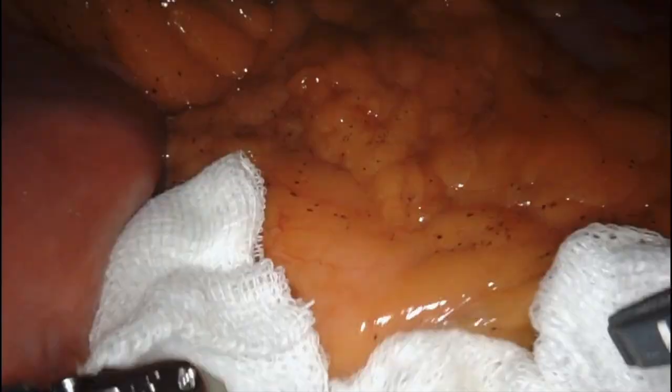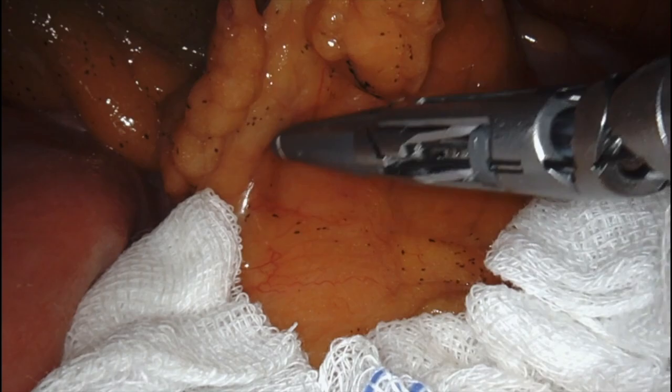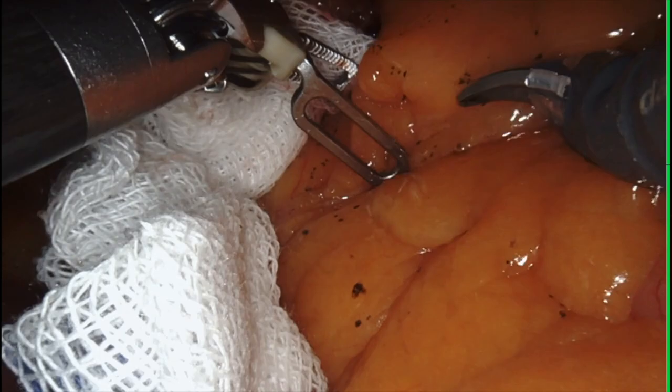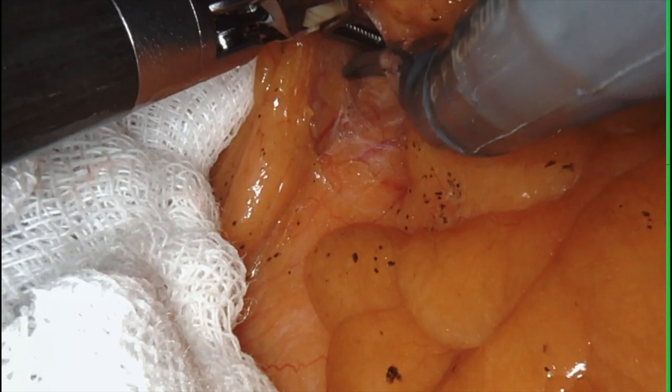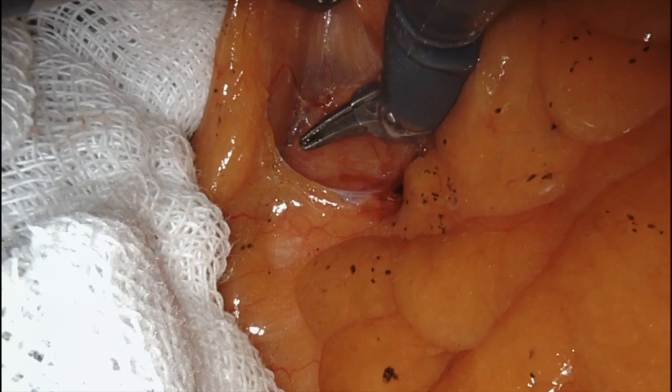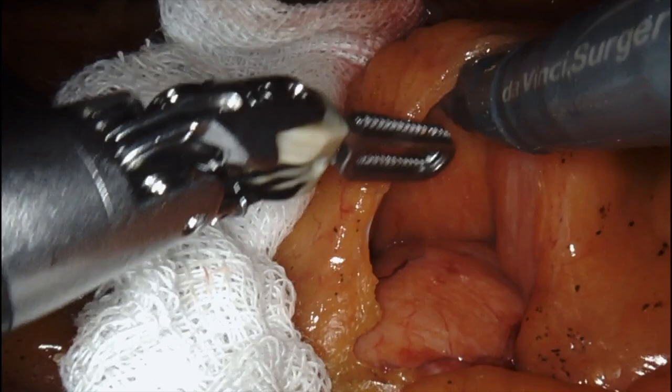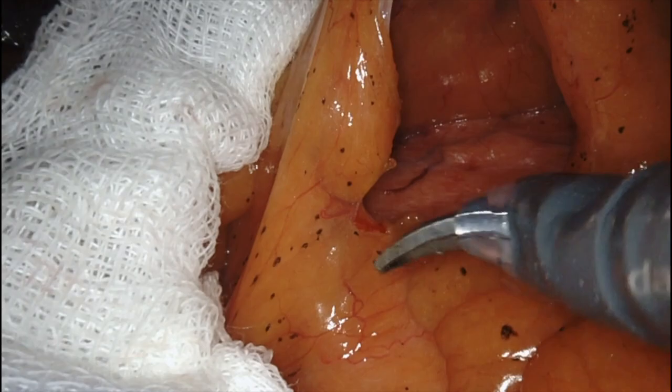First time posting in the RSC. This is a patient I did a splenic flexure resection on. He has a serrated adenoma of the colon, which on biopsy turned out to have dysplasia. He's a 72-year-old gentleman who has had colonoscopies since 2019. In those colonoscopies, the adenoma was attempted to be resected but could not be, so he was under surveillance, and when he developed dysplasia he was sent for surgery.